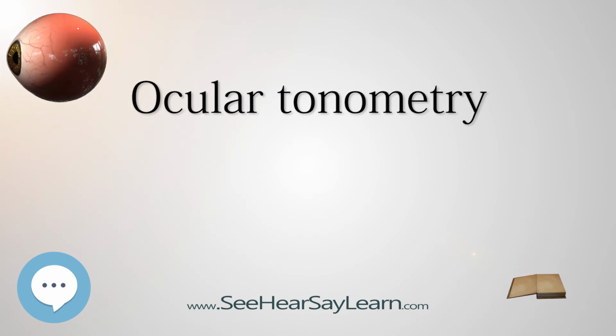Palpation. Palpation, also known as digital tonometry, is the method of estimating intraocular pressure by gently pressing the index finger against the cornea of a closed eye. This method is notoriously unreliable.